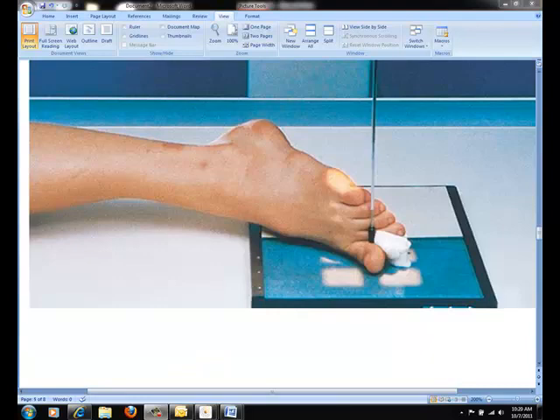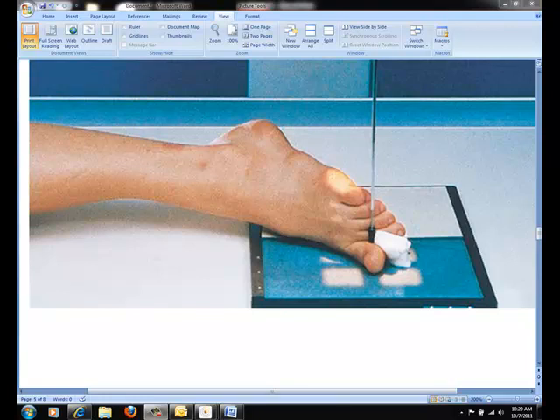Lateral projections of the toes are similar to those of the fingers. They can be performed medial-lateral or lateral-medial, depending on the toe of interest. Typically, you want to have the patient lie in the lateral recumbent position of the affected side, closest to the IR.